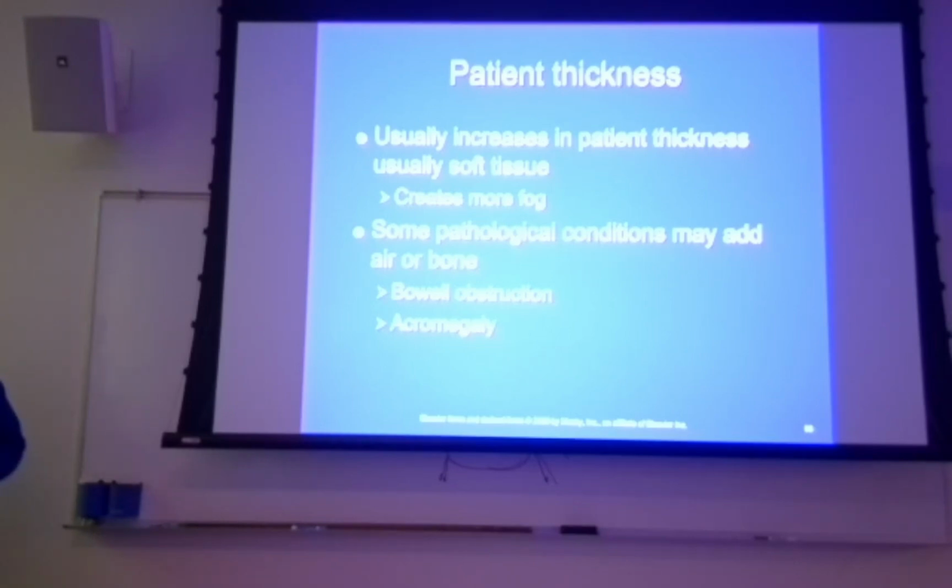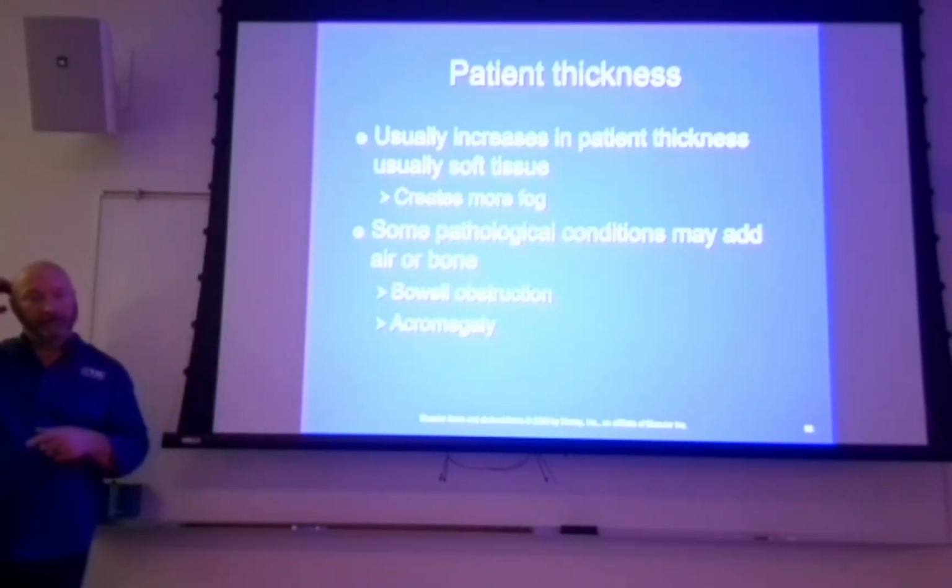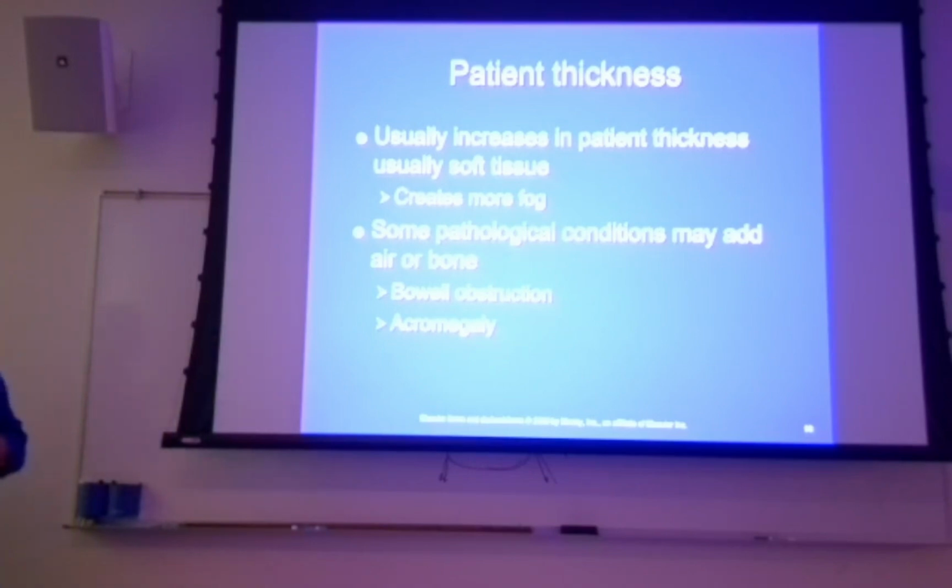Bowel obstruction, they're full of air, right? So if they're full of air, you definitely don't need to increase your technique. You may need to decrease your technique.